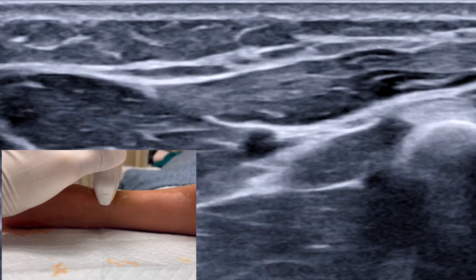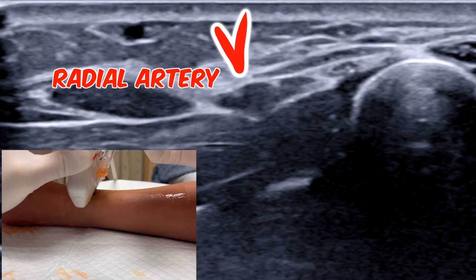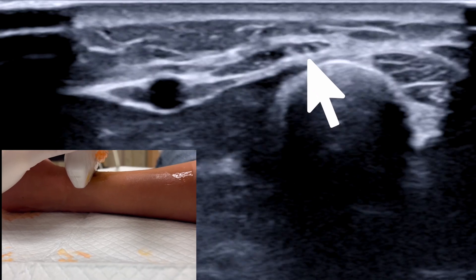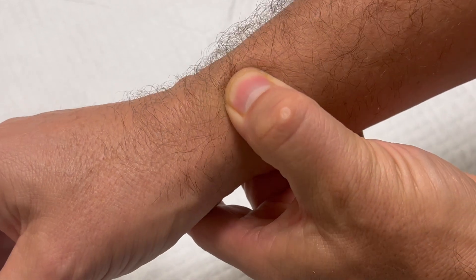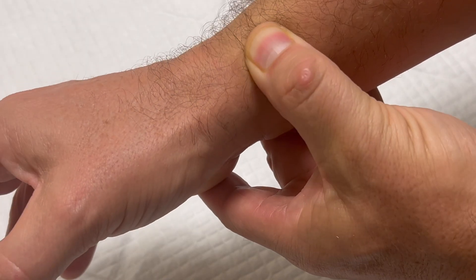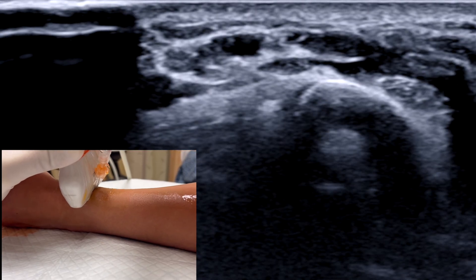For the radial nerve, the wrist is slightly pronated so the probe can be placed over the radial styloid process. Look for the radial artery and then a small nerve just lateral to that — that's the superficial branch of the radial nerve. As you scan distally, it will leave the artery and lie immediately superficial to the styloid process. You can often feel that nerve as a taut string rolling back and forth over the bone, which often elicits a paresthesia. The needle is inserted out of plane just subcutaneously and one to three mils administered.